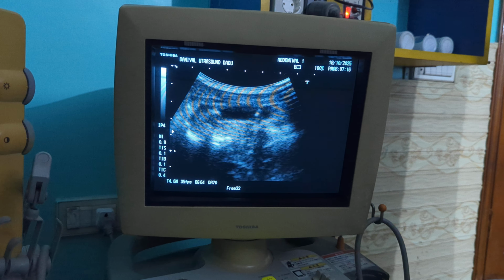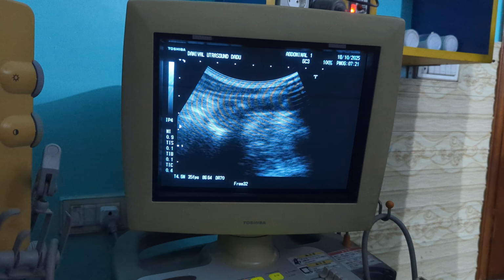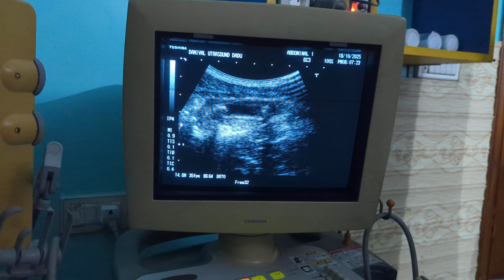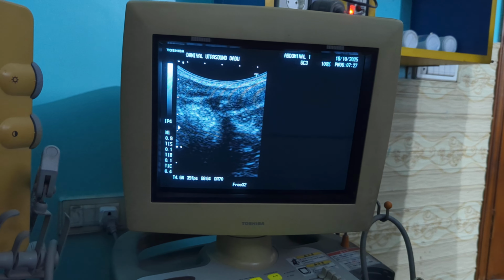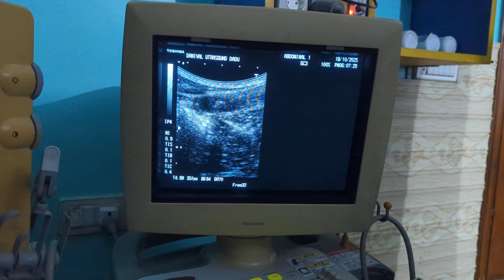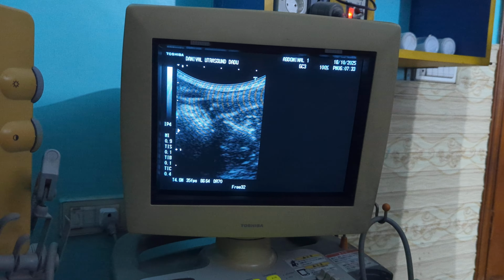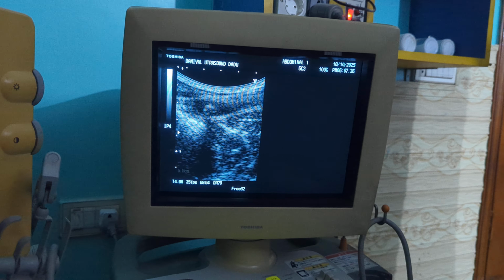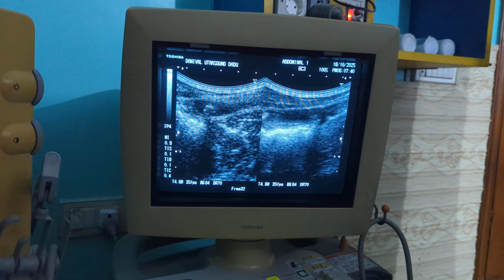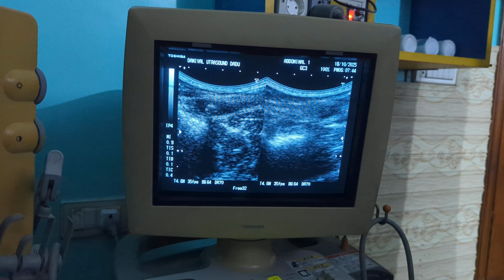Patient has to undergo operative procedure so as to remove the appendix, and this was the main reason that this is the transverse section in which both appendicular lumen as well as this appendicolith is visualized, and this is the longitudinal section which is taken for the surgeon to understand or give its proof.